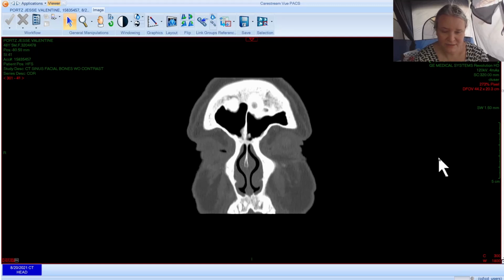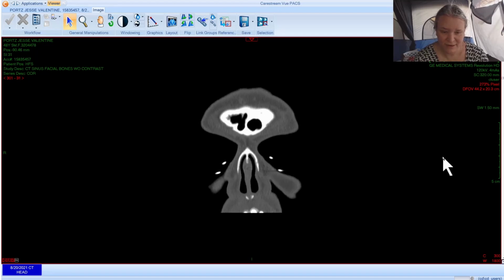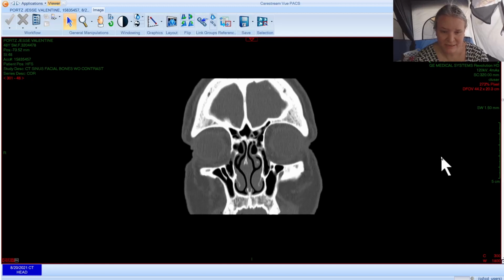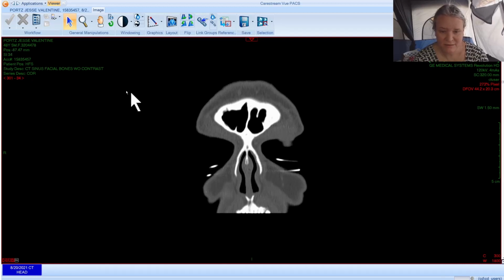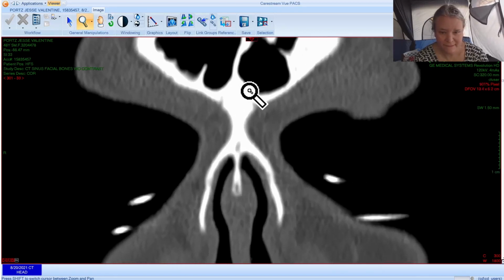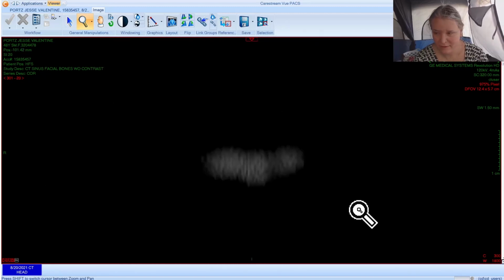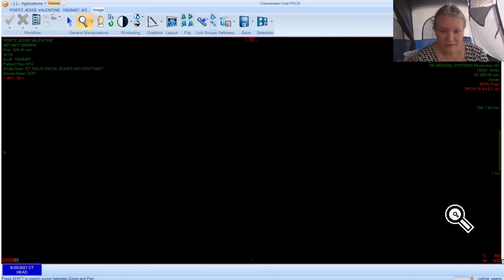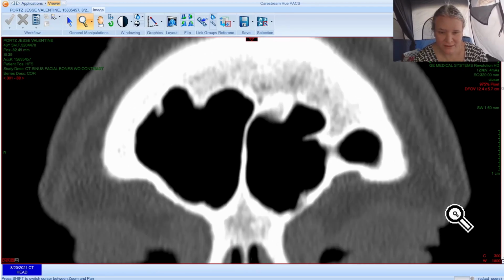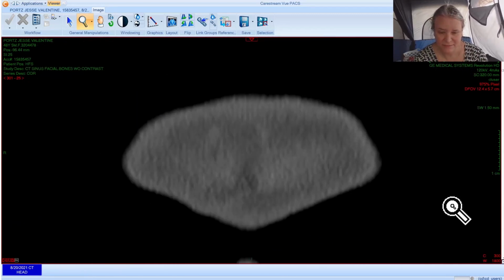This is from the front. So this is entering the forehead, the brow. You can see the nose. That's the aeration area. So looking at it from the front, there's the large aeration area in the brow, and going back, pretty significant.